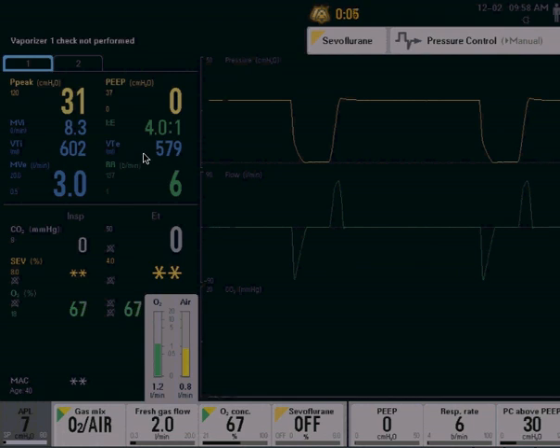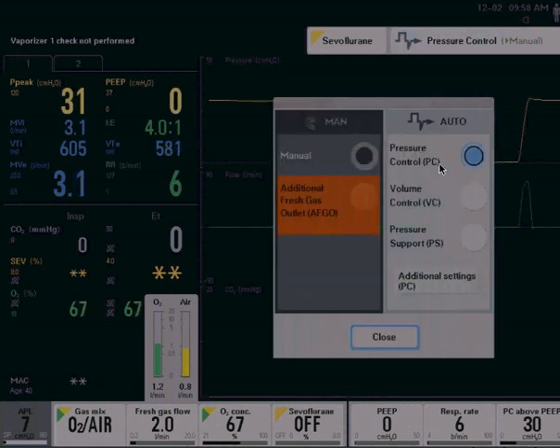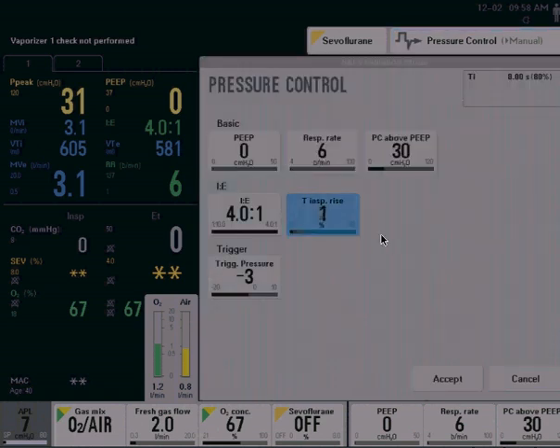So I have a higher exhale tidal volume, so I'm going to have to titrate my pressure control level and possibly my PEEP level. So I'm going to go back to pressure control. To adjust my settings, I'm going to change my inspiratory rise time and make it faster. So in my release phase, or my expiratory phase, to get to a quick P high phase, I'm decreasing my pressure control level, or P high if you want to call it that.